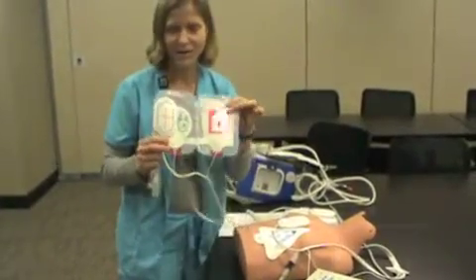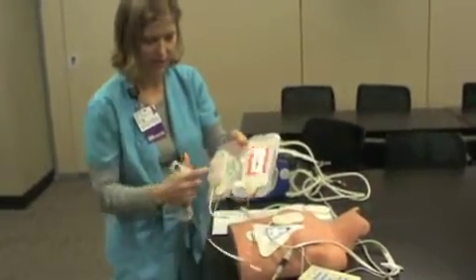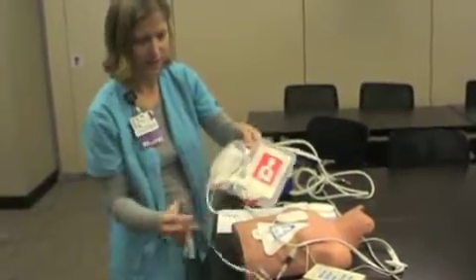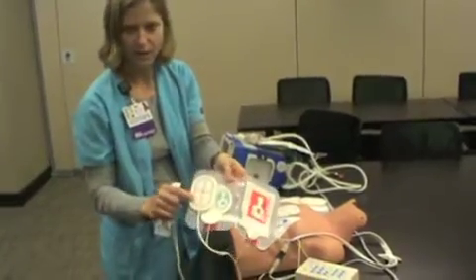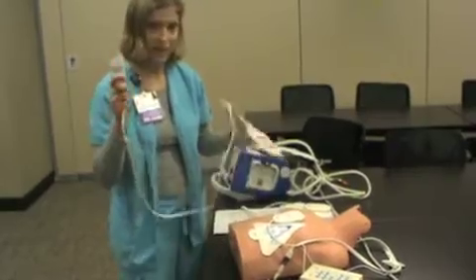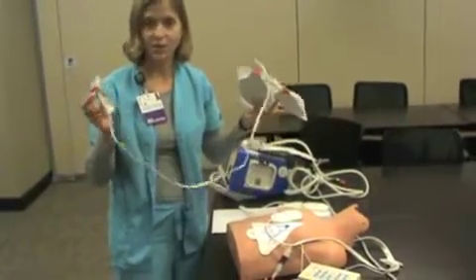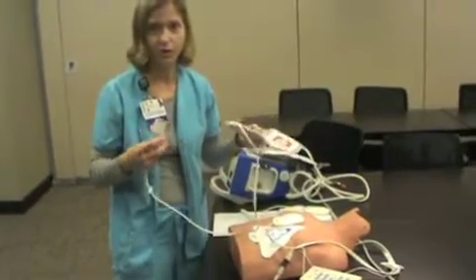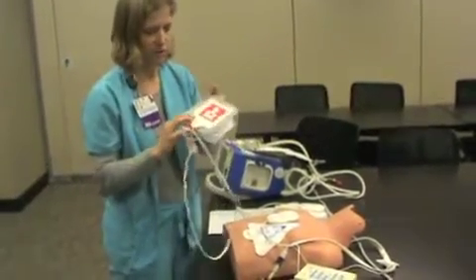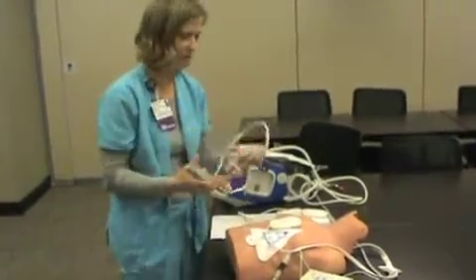If your unit has pediatrics, you'll have these pediatric pads. So they have the pictures similarly, anterior, posterior placement. The CPR feedback device goes on the sternum. And then when you plug this in, it automatically tells the defibrillator that you have a child hooked up. So it is going to dial down the joules for you, and it will also give you feedback that's appropriate for a child.